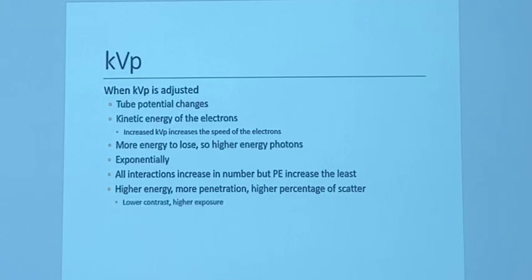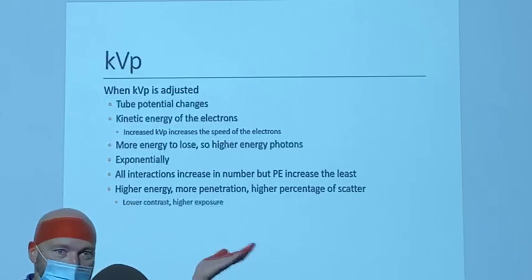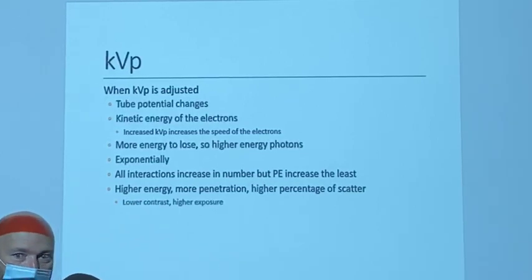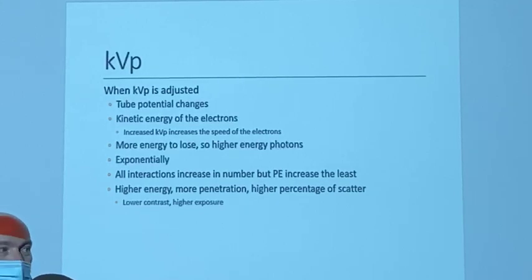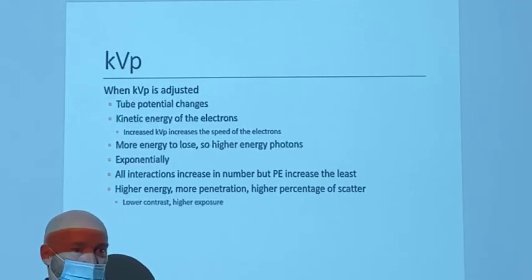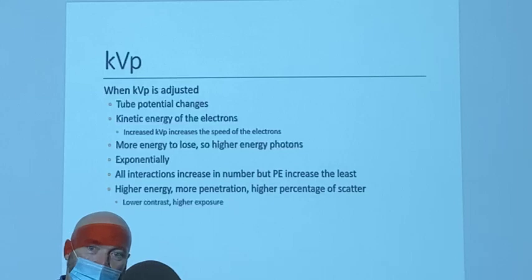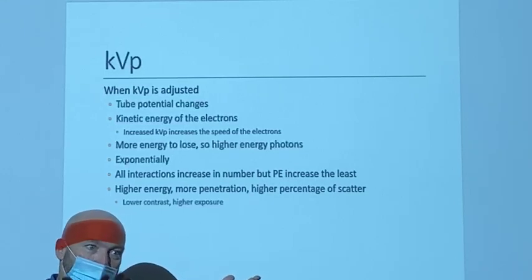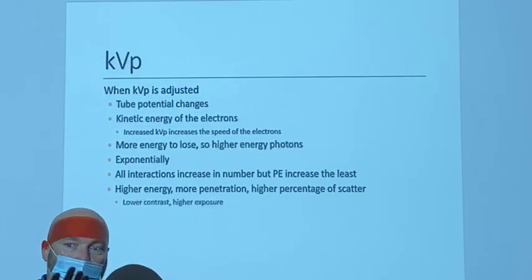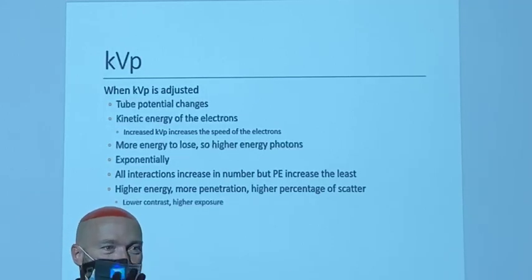All right, so let's stop on that. We've got a tissue type that either blocks all X-rays or transmits all X-rays. How many shades of gray will we have? We have two, right? It's perfectly clear and totally opaque, right? The image on the screen. So we only have two. But if I change my KVP and I could penetrate a little bit of this one, and this one still blocks no X-rays at all, then what's the difference there?